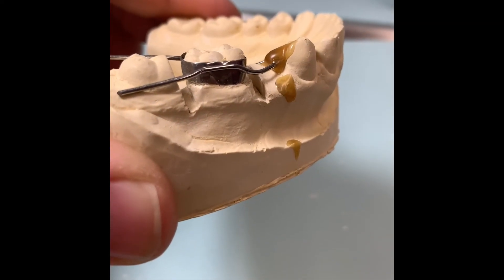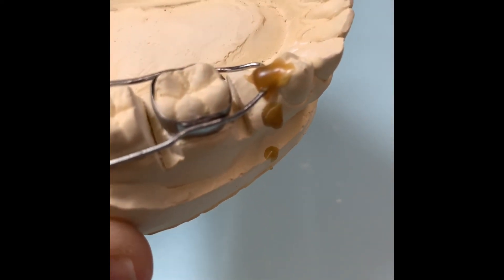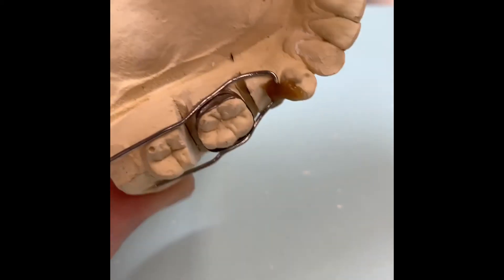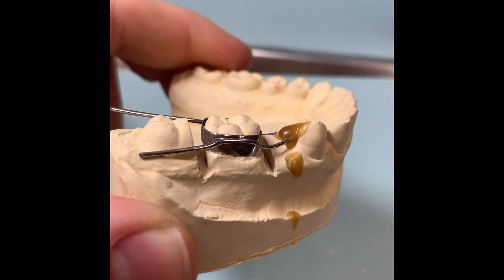Once you finish all your bends, you want to make sure you sticky wax it, making sure the tooth and the wire are still contacting. The wire is touching the band on both lingual and buccal. And then we will get to solder — the soldering video would be up next.